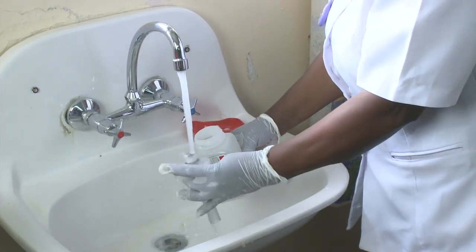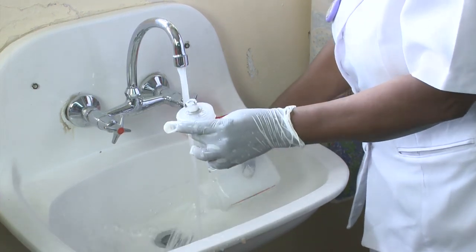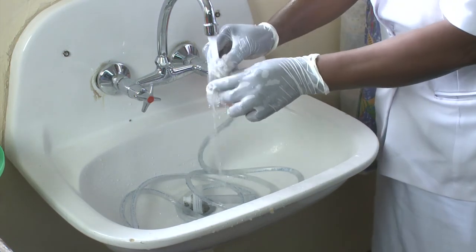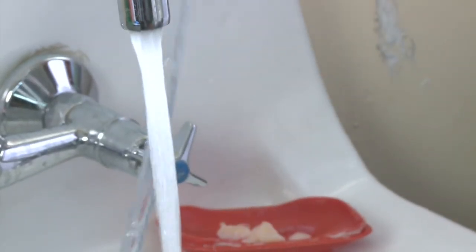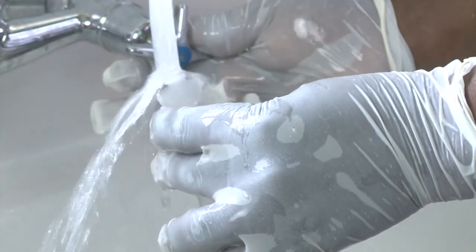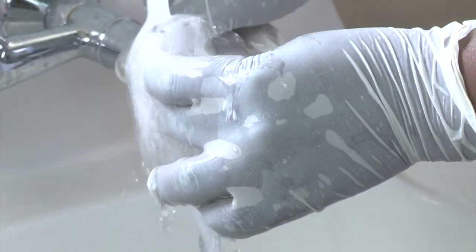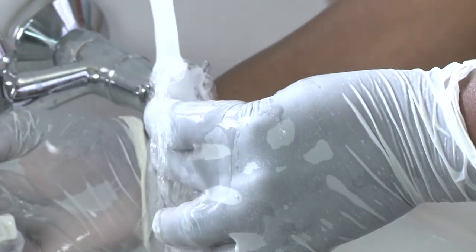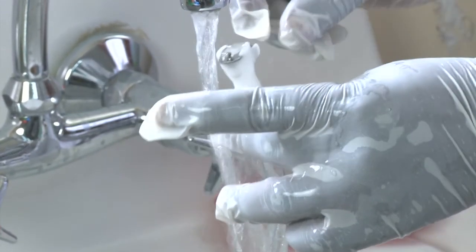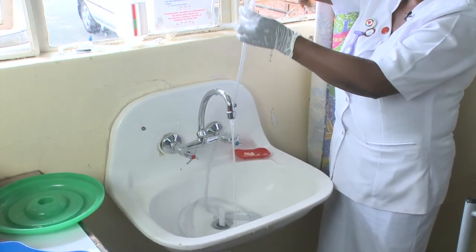After leaving for 10 minutes, you need to take everything to a tap. It needs to be rinsed thoroughly to get rid of the chlorine. Make sure there's some water going around the tube, and make sure you run water through the middle of the tubes.